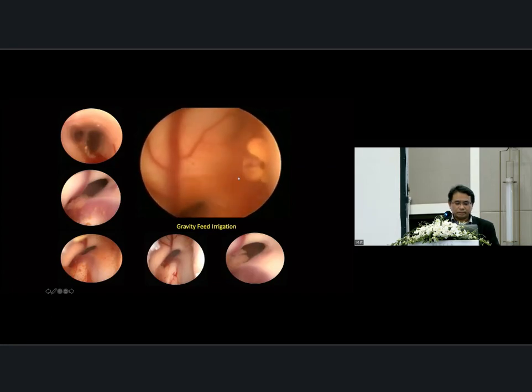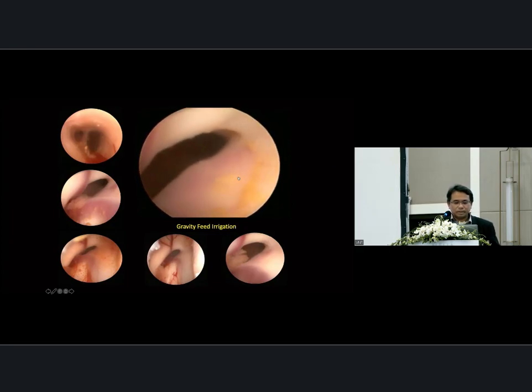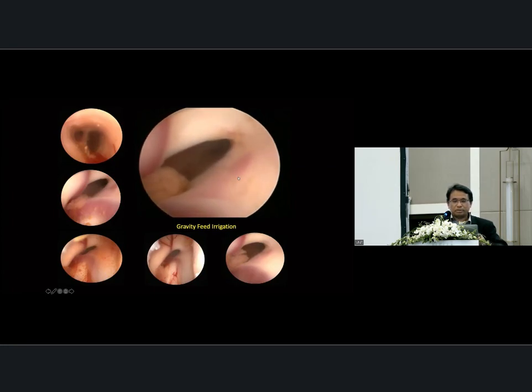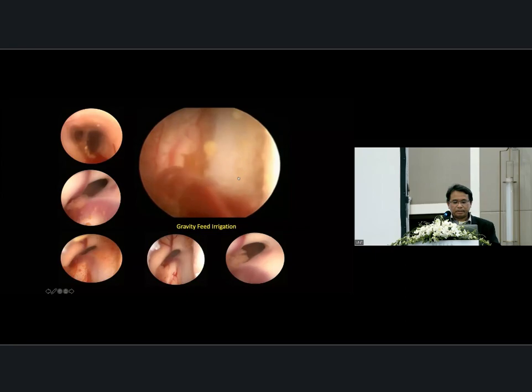You can also see that following IVH and infection, the ventricle wall becomes very stiff. This is how you can develop slit ventricle syndrome post-infection. As you slowly introduce the scope, now I can start to release some of the previous hemosiderin, and then you can really realize that the foramen of Monro starts to give way. It becomes softer from stiff, and you can remove all this debris, which definitely can get into the shunt and cause blockage.